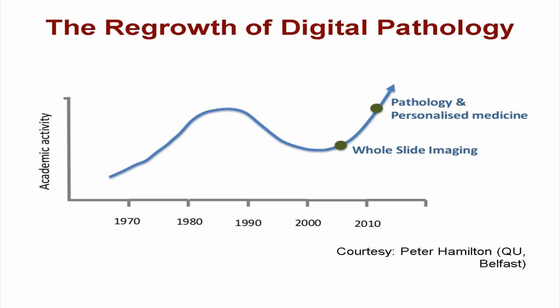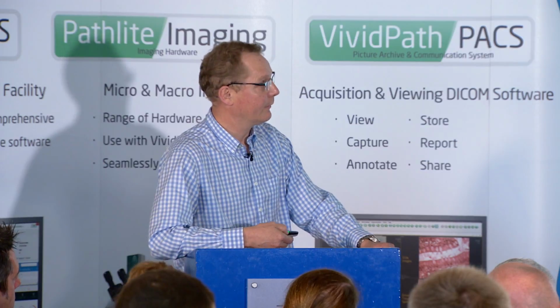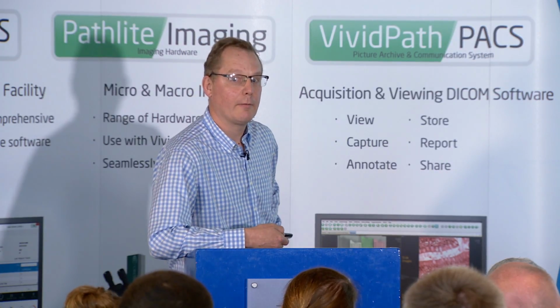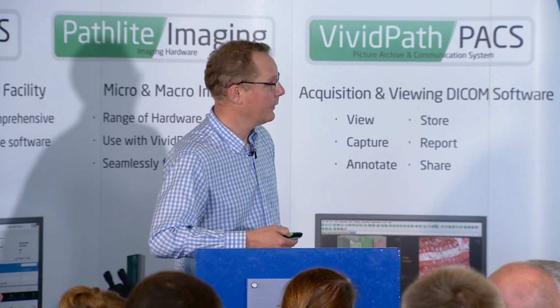And I think, as Richard pointed out, possibly more than once, pathology generally takes a long time. So digital pathology goes back to the mid-60s, in fact, when people first started putting together images and computers to analyse them. But really, it's not been until relatively recently that we've had scanners that are capable of dealing with whole slide imaging on a scale that's required for routine diagnostic work. Our lab in Coventry produces 1,000 slides a day, and just getting through that scanning time is a significant hurdle, and only now really have we got the equipment that can do that.